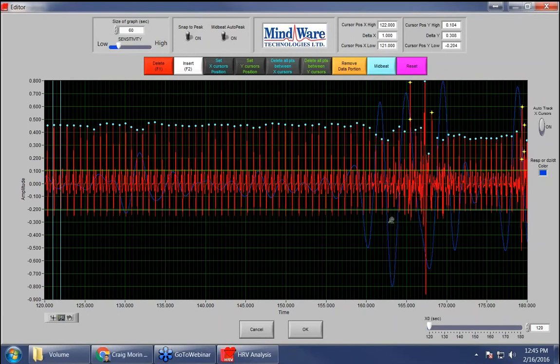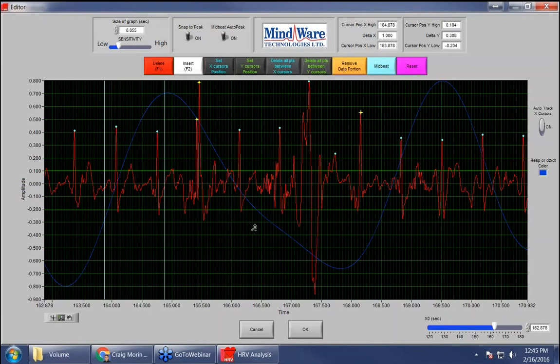So we just click on that and then click and drag to the area that you want to look at, to give you a closer view. Okay, so this looks like maybe there was some motion artifact or something. It's hard to say exactly what it is. But in this instance, there's a few different things we can do. So I'll show you those methods.